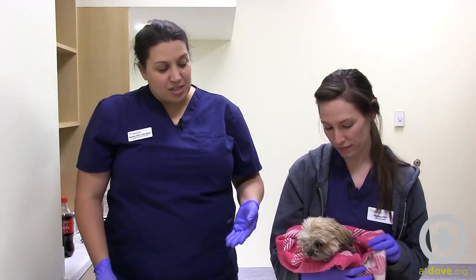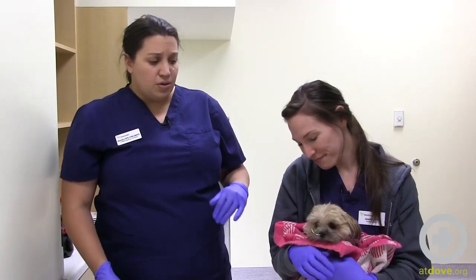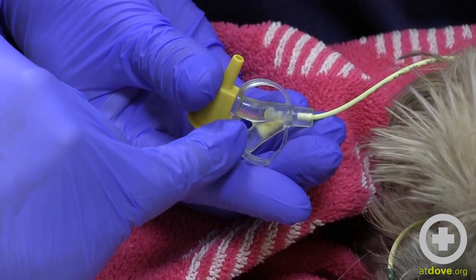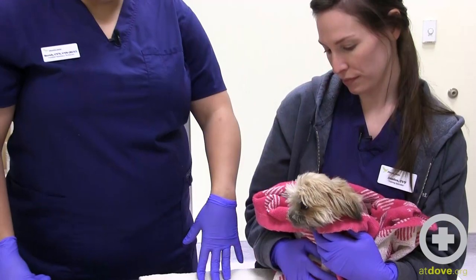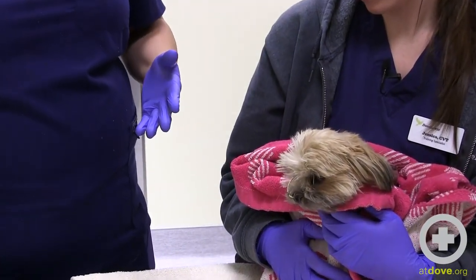The patients that are more susceptible to getting clogs in their tubes are ones like Leah, where they have really tiny noses and require really small tubes. The diameter of the tube is really small, and things are much more likely to get clogged.